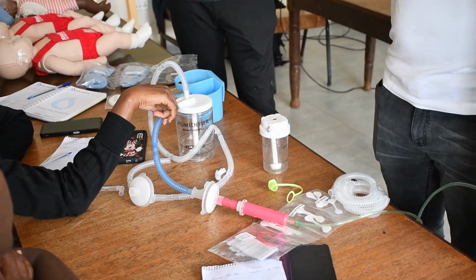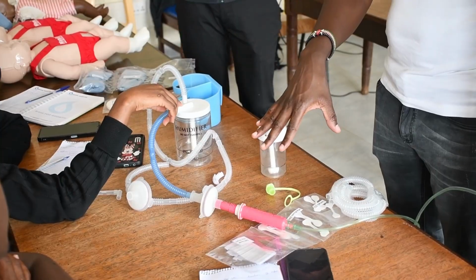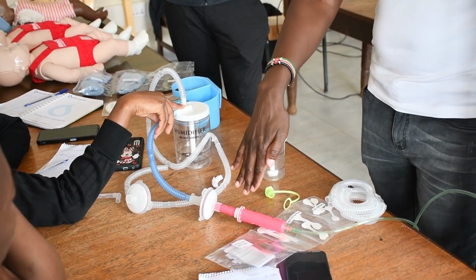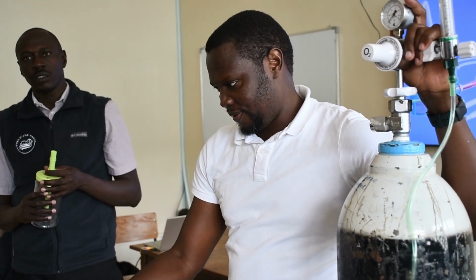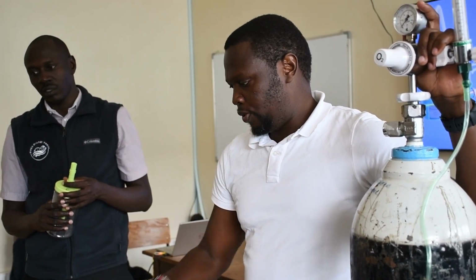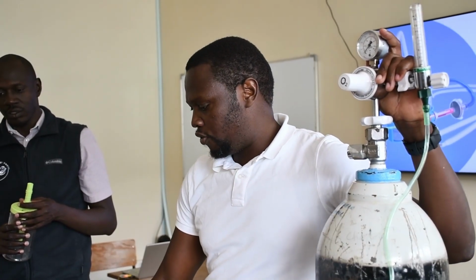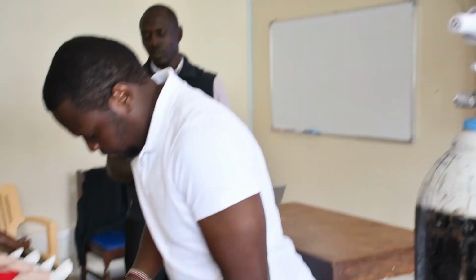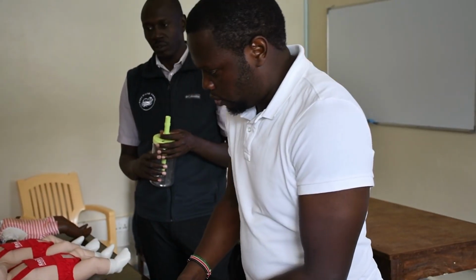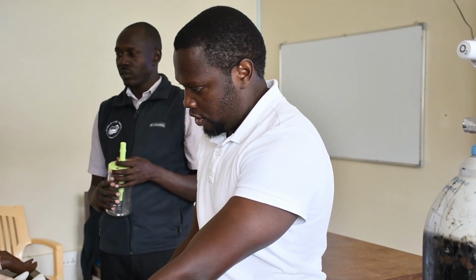So what happens here is that we reduce the concentration levels. When you reduce the concentration levels, then there is that positive pressure. So the positive pressure is always with the device. This is only for humidification. Whatever is passing only passes here for that function, because you don't want to provide the neonate with dry gases. Okay?